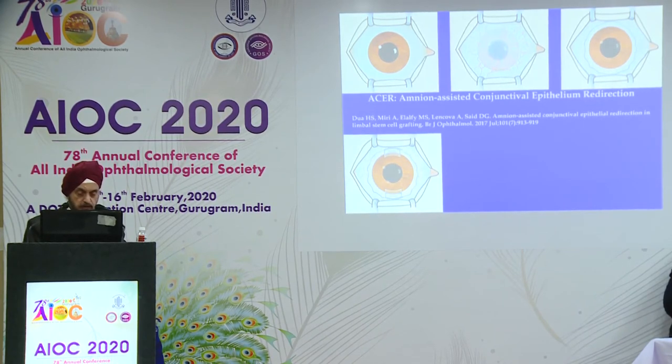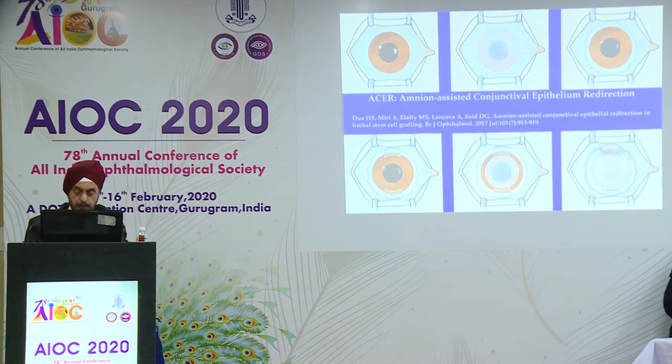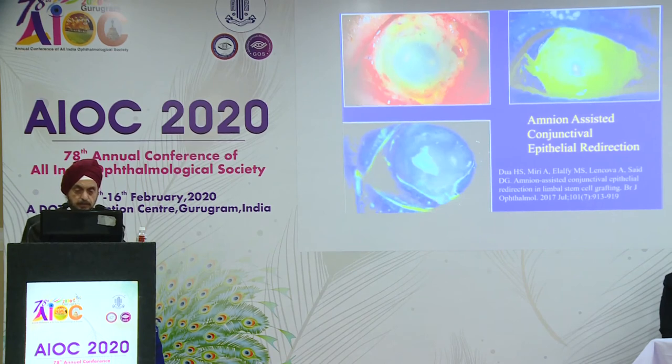If the bed is not nice, you can put a little amniotic membrane on the inside, which is irrelevant. But the main step is the next one, where you take a large sheet of amniotic membrane and put it underneath the conjunctival edge so that this conjunctiva is forced to grow on the membrane, not on the cornea surface. So it has no chance to mix with the stem cell derived epithelium coming from the explants. So here's an example. You can see we've done that.